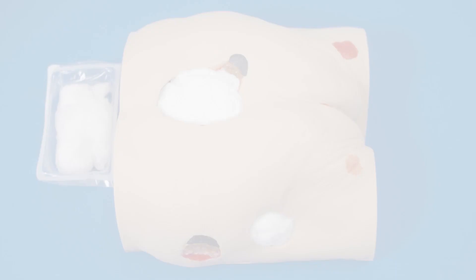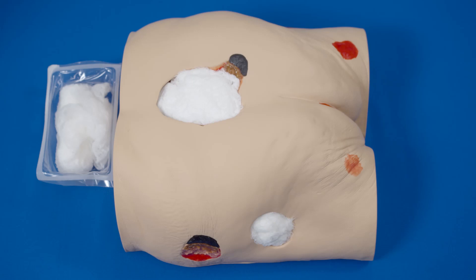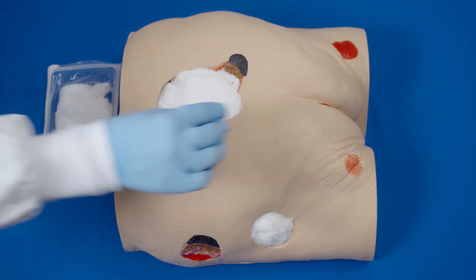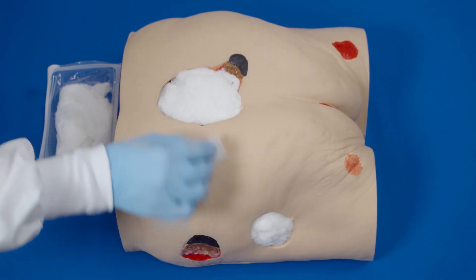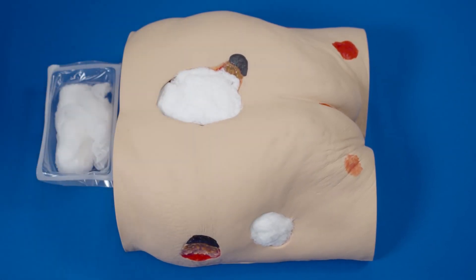Do not cut the gauze directly over the wound. Do not allow the gauze to overlap onto intact skin. If filling a tunnel, ensure the gauze in the tunnel connects with the gauze in the wound bed. Select an area to bridge the two wounds together.